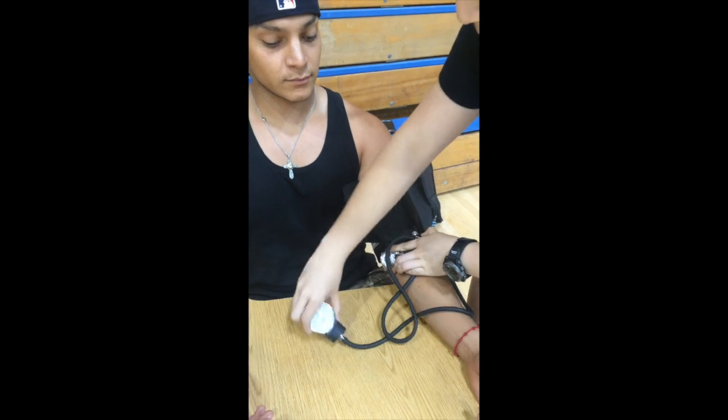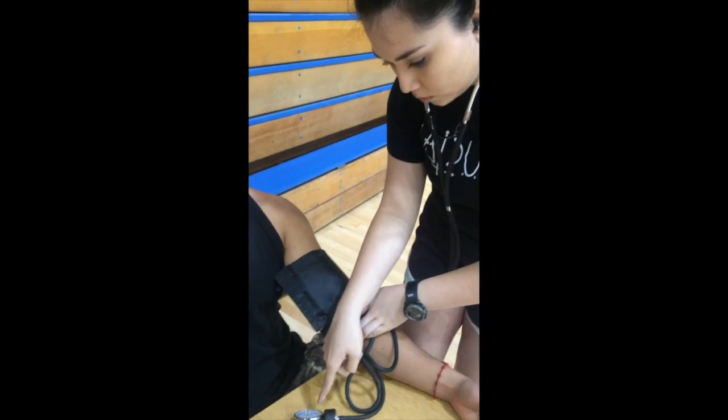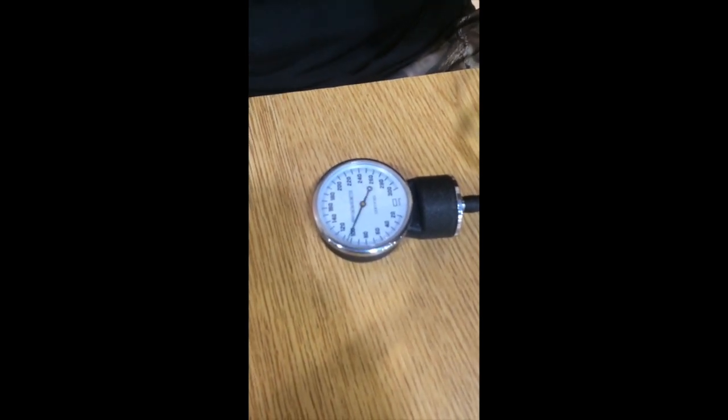Do not place your fingers on top of the bell. Make sure to place the gauge in a visible position where you can attain an accurate measurement. Take the pump in your dominant hand and begin pumping up to 200 mm of mercury. After you have pumped up to 200 mm of mercury, begin to turn the valve counterclockwise, decreasing 2–5 mm of mercury per second.